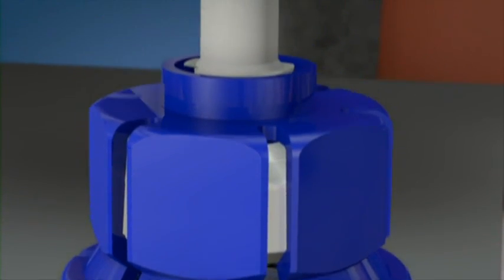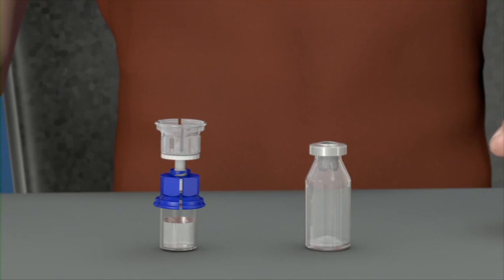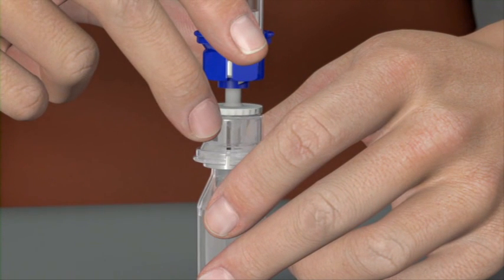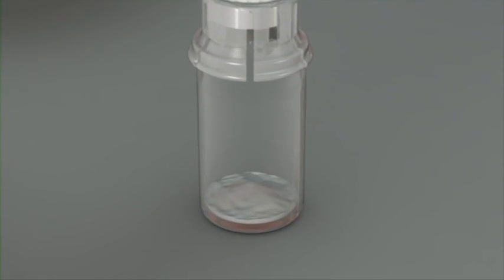Make sure that you only pull up the package and not the Mix2 Vial set as well. Place the powder product vial firmly on a surface and hold it tight. Turn the diluent vial with the Mix2 Vial set attached upside down and snap the transparent adapter onto the product vial stopper.